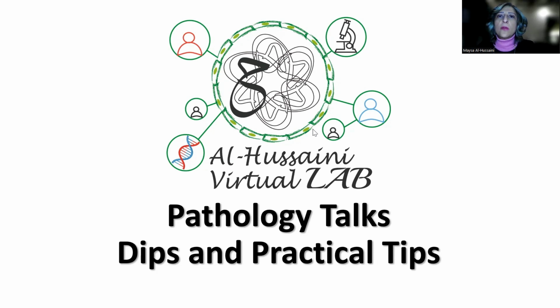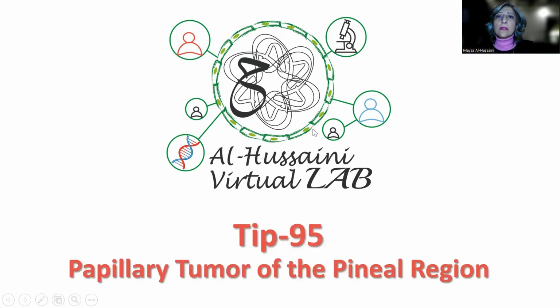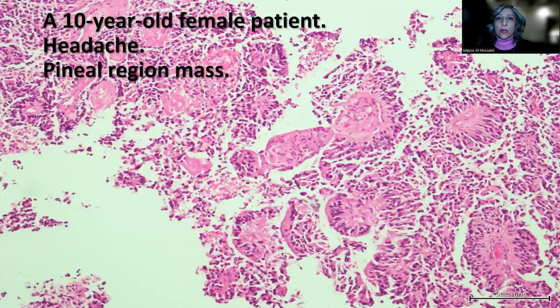What I'm going to be sharing with you today is a nice example of papillary tumor of the pineal region. So this is a case of a 10-year-old female patient who presented complaining of repeated attacks of headache, and on imaging was found to have a pineal region mass.